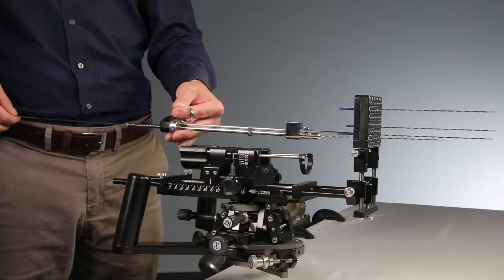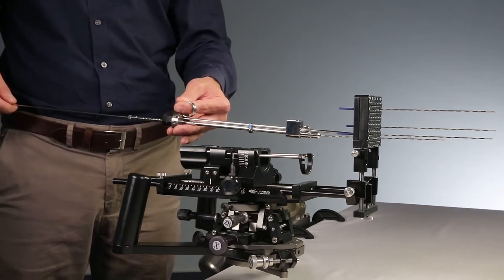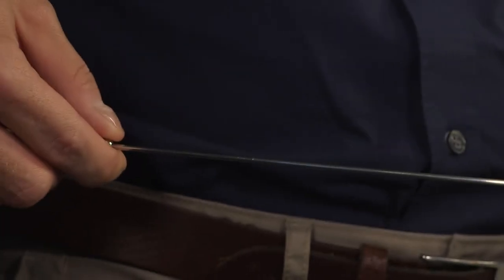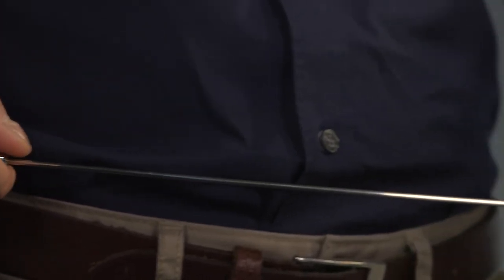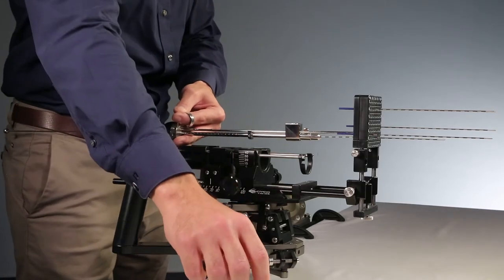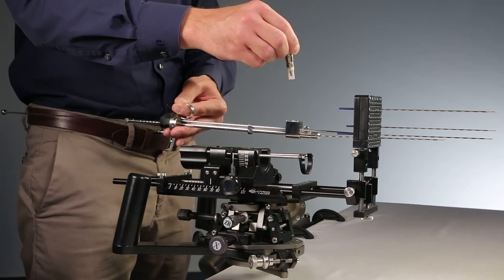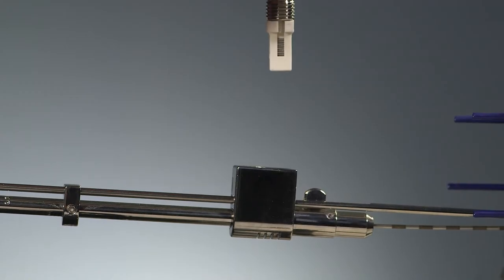Before loading the magazine with the seeds into the applicator, assure that the push wire rod is pulled out as far as possible. Then, insert the magazine loaded with seeds into the well of the magazine receptor. Please note that the seeds must face towards the right.